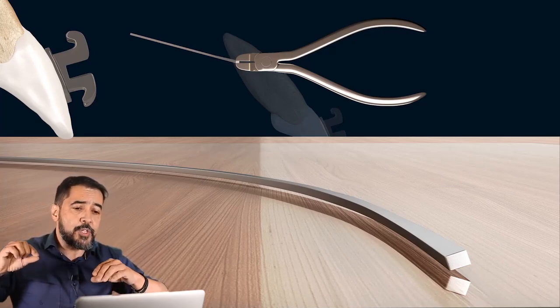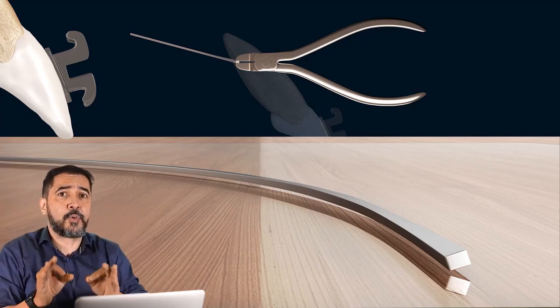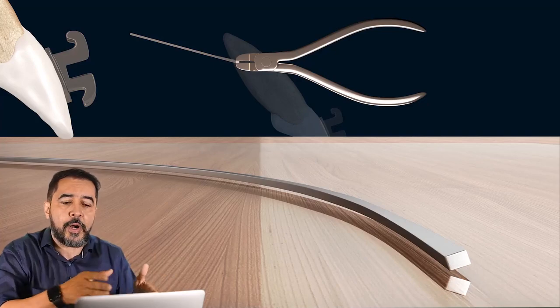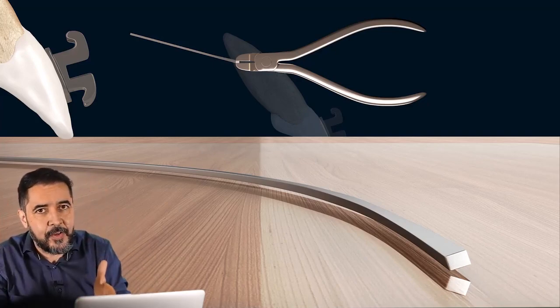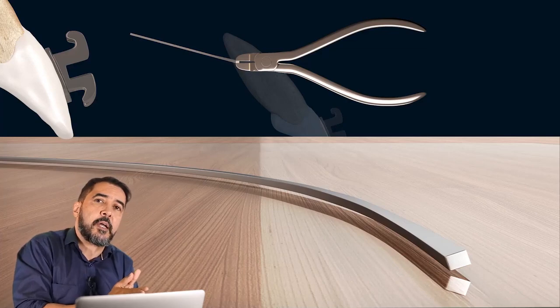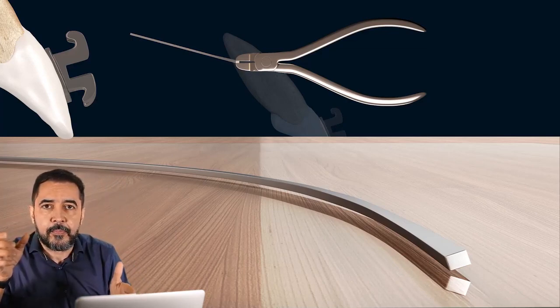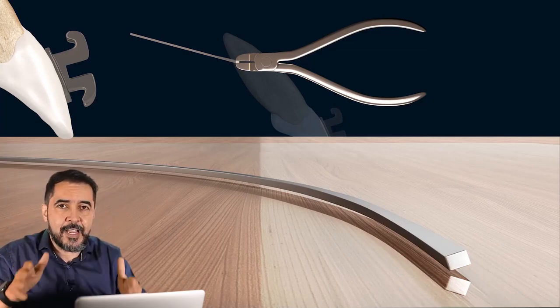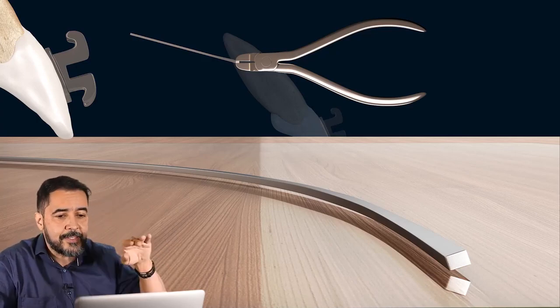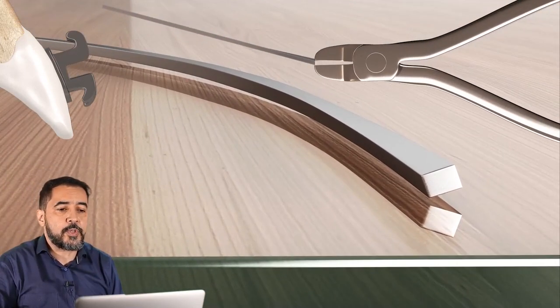So in this situation, to have a passive relationship, what matters here is the relative torque. To have a passive relative torque, we can't generate an active relationship. So be aware of that, anytime you put a rectangular arch wire inside a slot.